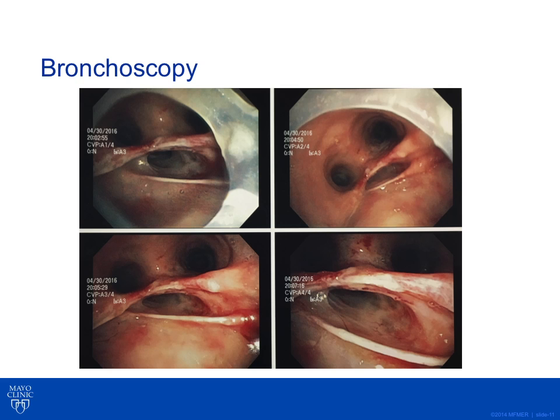A video bronchoscopy was performed showing the posterior membranous tear. The right and left mainstem bronchi can clearly be seen. The posterior membranous tear also shows ragged edges with a fluid-filled mediastinum that already has purulent debris. The tip of the endotracheal tube clearly passed distal to the carina posteriorly, and that track is well-established, suggesting the tube may have been there for quite some time. It is possible the patient stayed alive because the tear was large enough to allow ventilation of the mediastinum into the lungs.